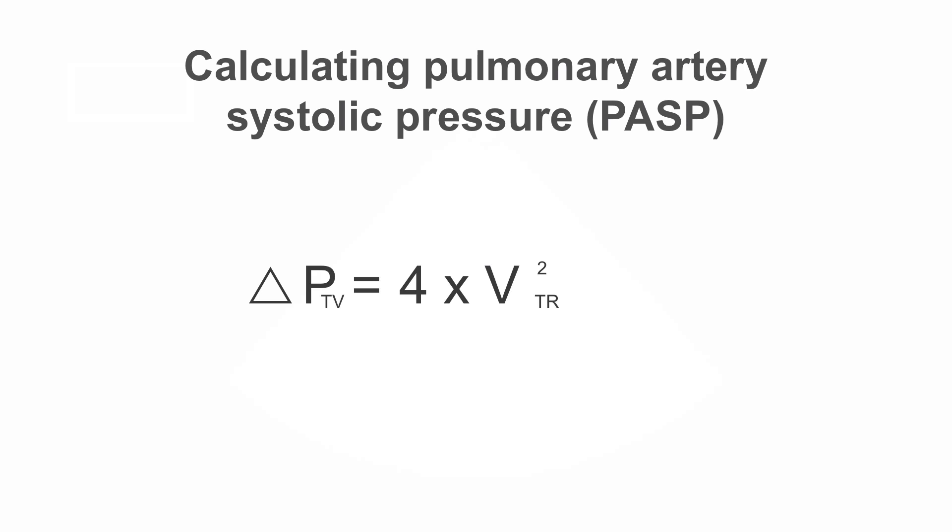We'll use the 291 centimeters per second obtained in the prior tracing, but need to change this value to meters per second, so it's now 2.91. With this, we can calculate the pressure gradient across the tricuspid valve. It's 33.9. Now we have the delta pressure.